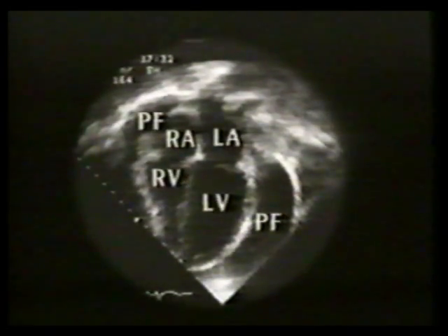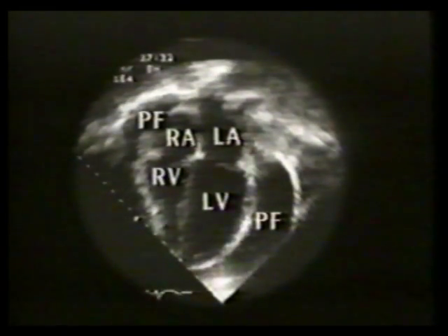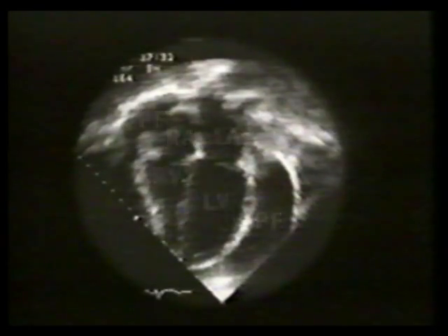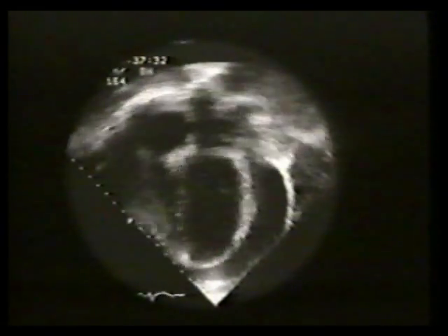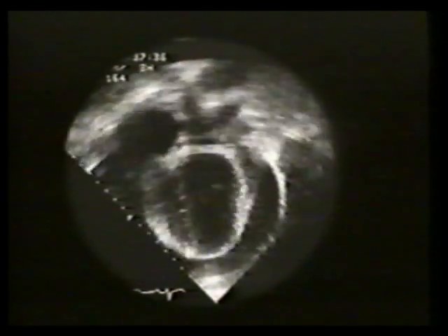Echocardiography has long been recognized as the gold standard for diagnosis and follow-up of pericardial effusion. Similarly, echocardiography can be used to delineate pericardial masses and cysts. In recent years, it has become apparent that Doppler echocardiography provides a non-invasive means of precisely characterizing hemodynamic disturbances due to pericardial pathology.